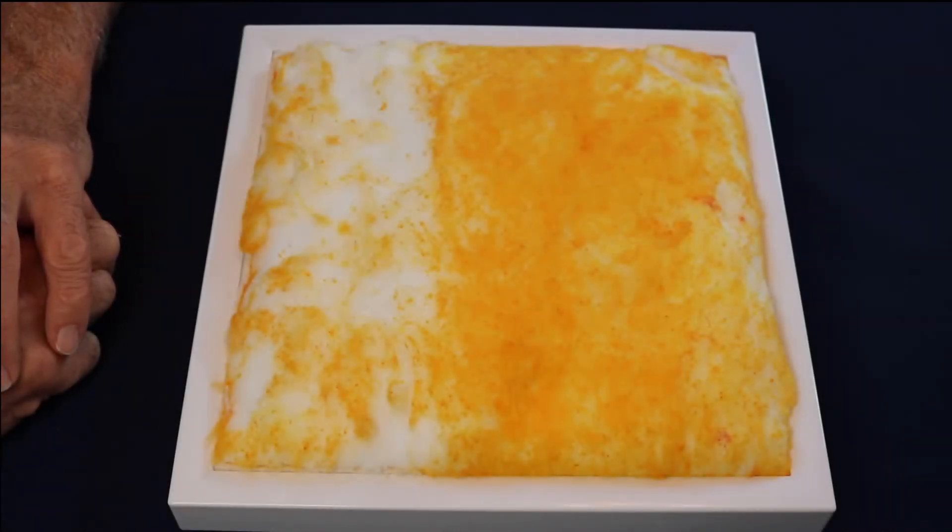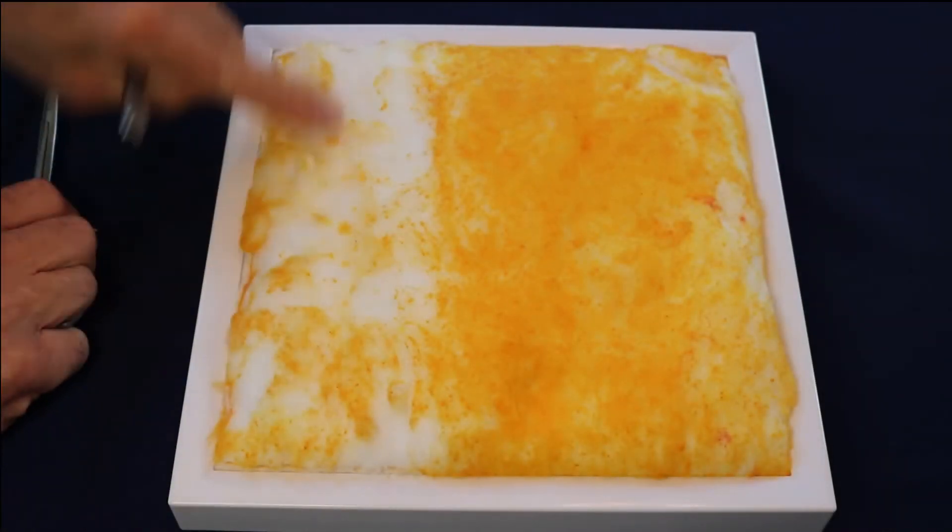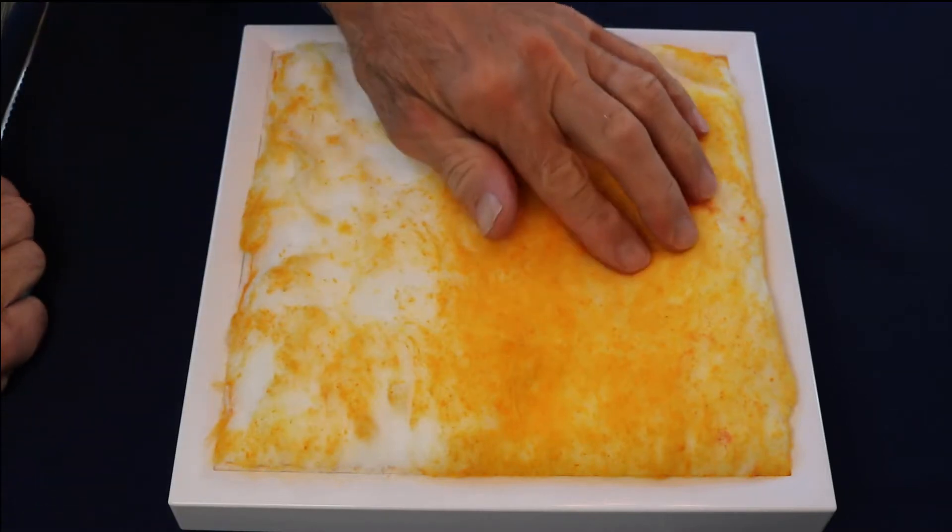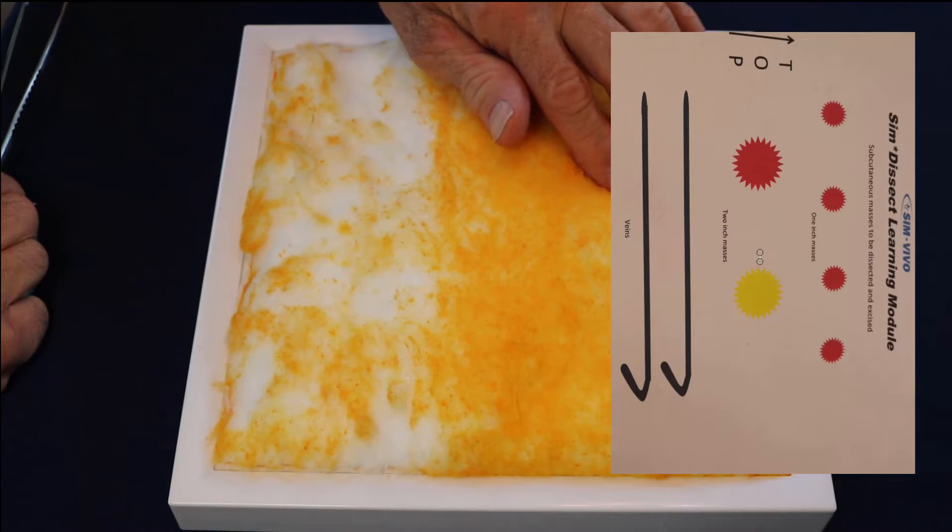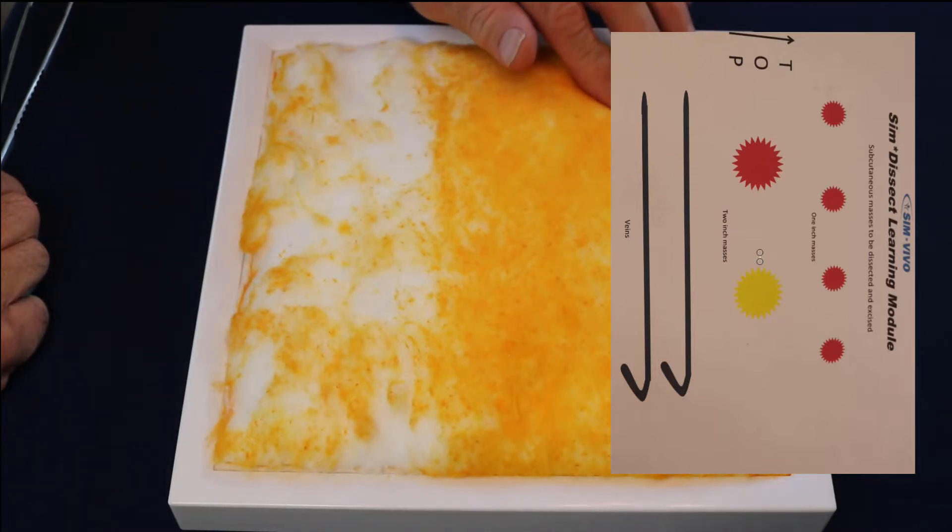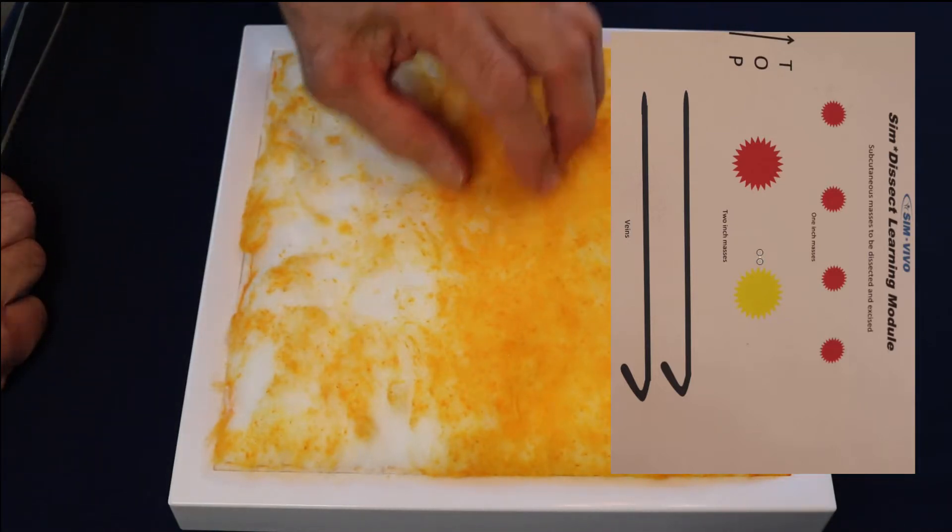Now it's time to put it all together. Once the material has been removed from the surface of the module, palpation will reveal several lumps that are buried deeply. This is a representation of what you will find within the simulated subcutaneous tissue.